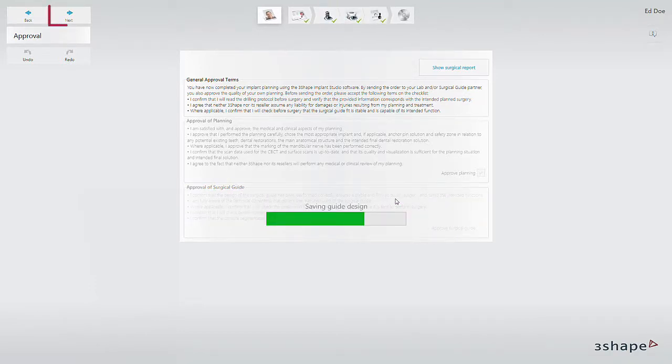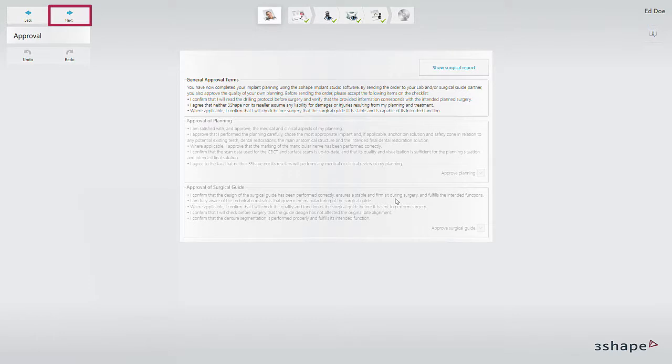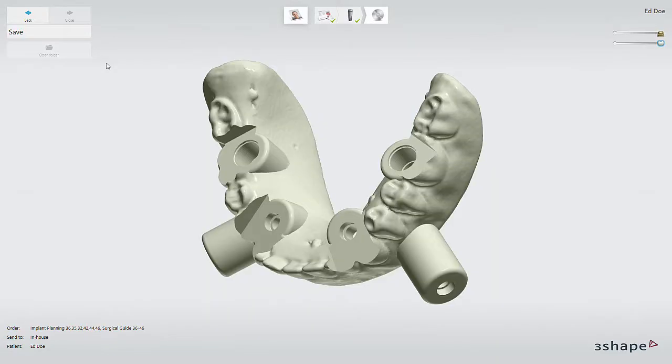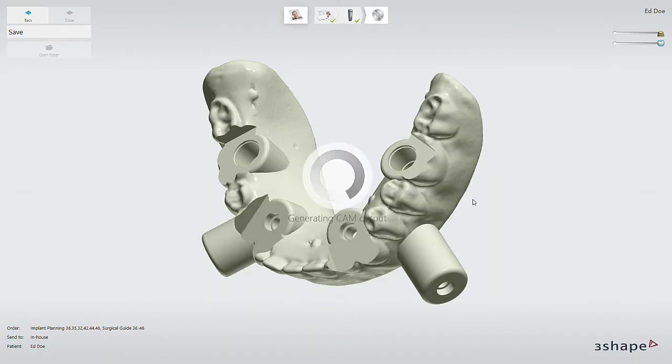Now you're able to click next to proceed. The CAM output will be generated automatically. Once it's fully generated, you can click on open folder to view the output data.